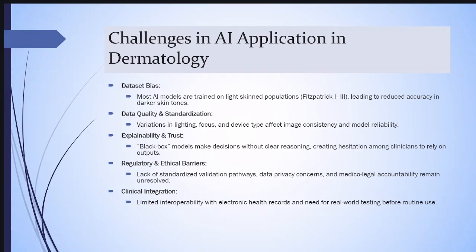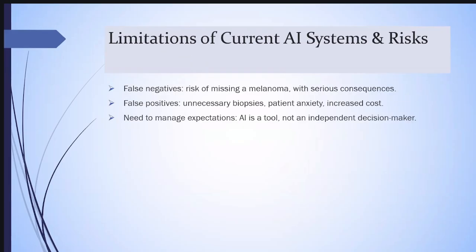And clinical integration: the limited interoperability with electronic health records and the need for real world testing before it's just rolled out. So false negatives, if you're going to miss a melanoma, then it is a serious medical legal issue. And false positives mean unnecessary biopsies, patient anxiety, increased cost.